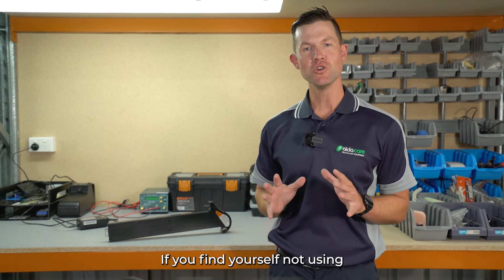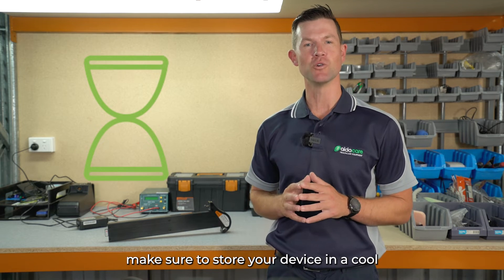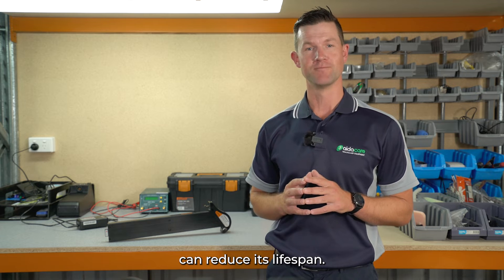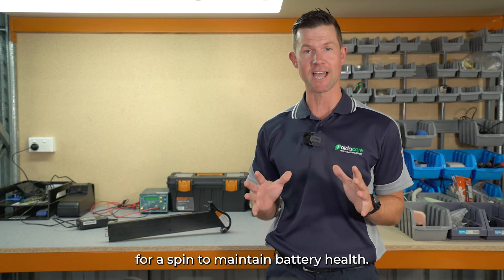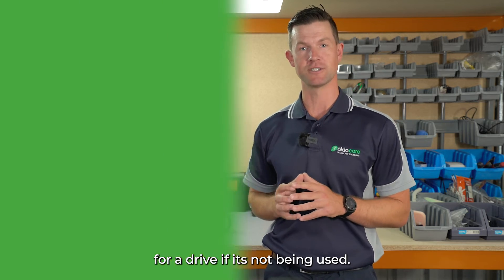If you find yourself not using your mobility device for extended periods, make sure to store your device in a cool, dry place with the battery fully charged. Storing with a fully depleted battery can reduce its lifespan. We recommend asking a family member or friend to take your mobility device for a spin to maintain its battery health, just as you would if you were taking your car for a drive if it's not being used.